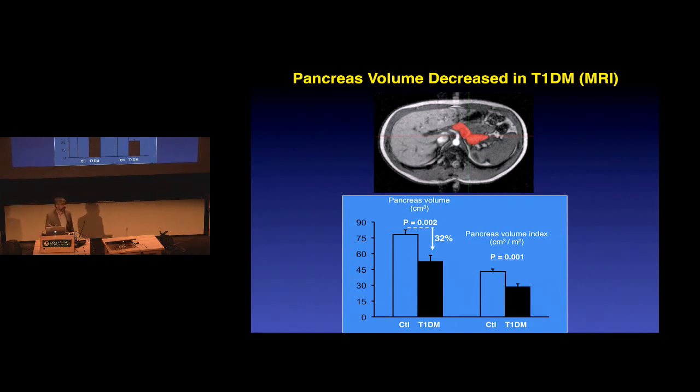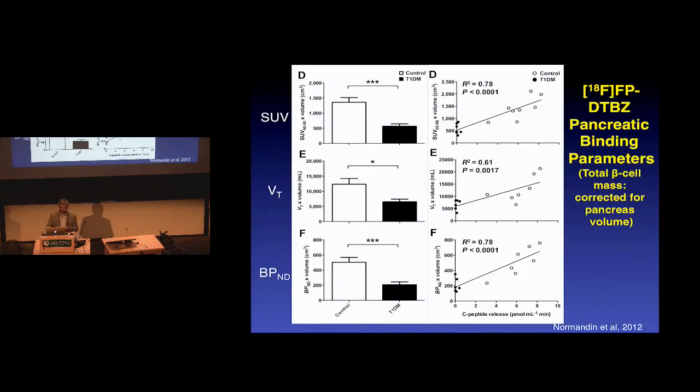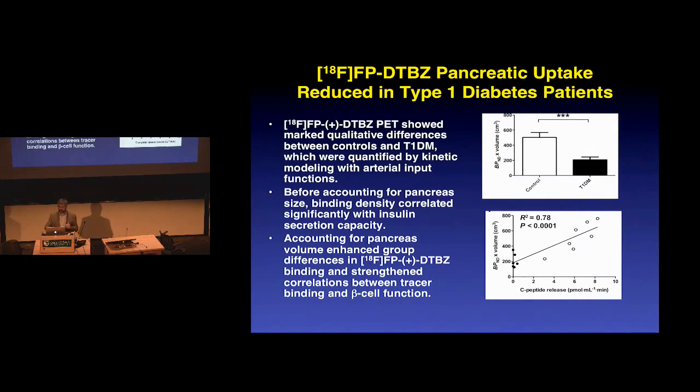If you remember, we have only so much resolution. If I have two identical objects and one smaller, if I'm not careful, I'm going to have a lower value, partial volume effect. We think we did it carefully, but when we correct for that, it's even a bigger effect. Depends on if you want to use that as an advantage or a disadvantage. So what we published was, it worked.